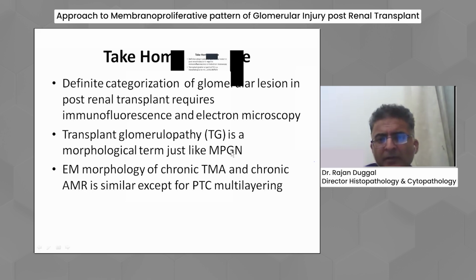So Dr. Anisha, when your differentials are chronic TMA or chronic ABMR in a post-transplant biopsy, how do you sign out the report?